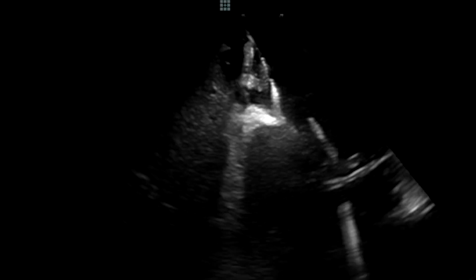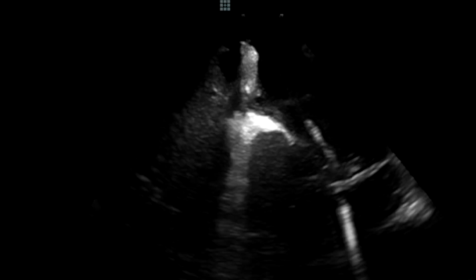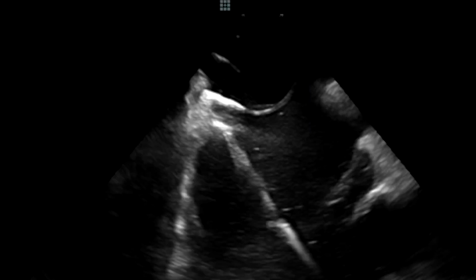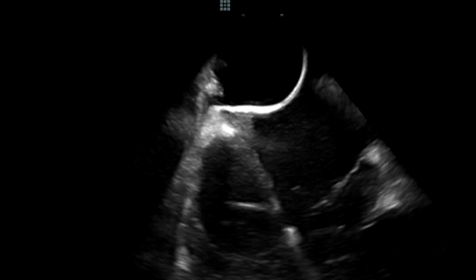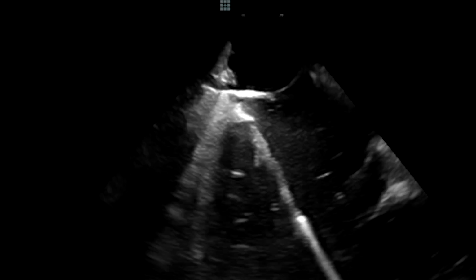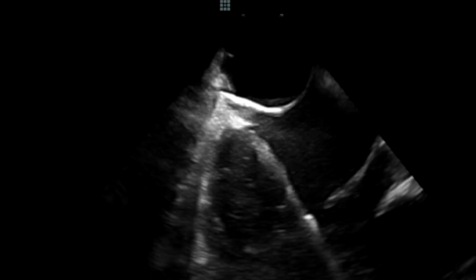Here you can appreciate, we can see that. If I'm pulling the ablation catheter back, that is going to be the distance between the ablation catheter and the floor of the pouch, and that would be the area where we may have a leak. So when we see that the pouch exists, we are able to perform a U-curve like a candy cane, place the tip of the ablation catheter inside the pouch, finish the ablation, and perform bidirectional block.